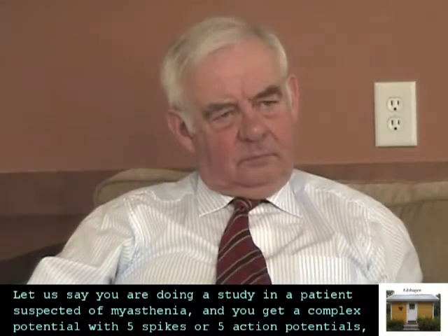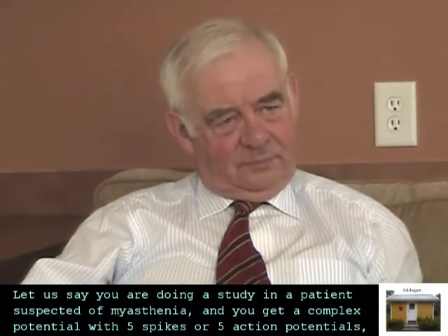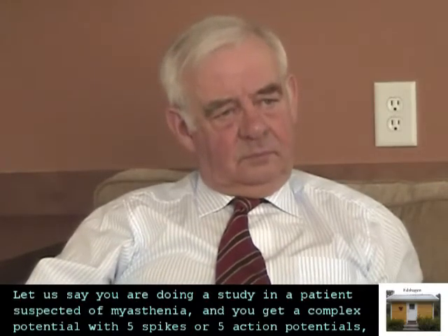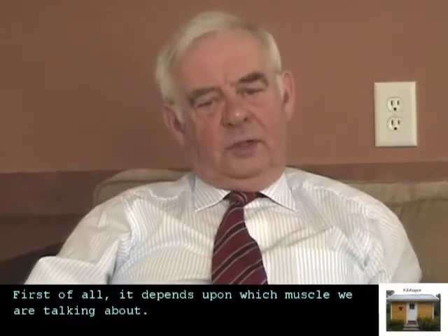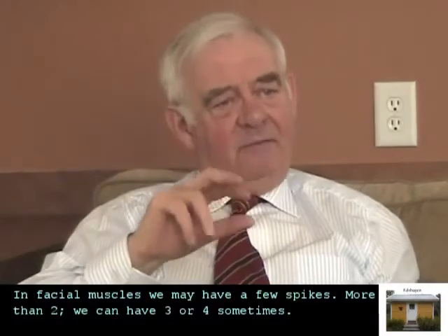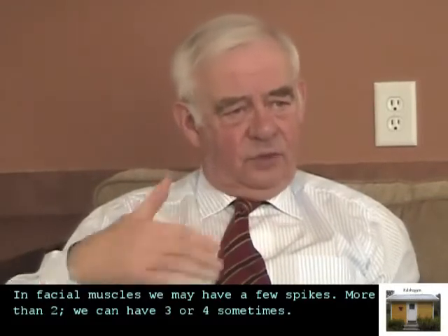Let's say you're doing a study in patients suspected of myasthenia, and you get a complex potential with 5 spikes or 5 action potentials. How many jitter analyses can you make from that recording? First of all, it depends on which muscle we are talking about. In facial muscle, we may have a few spikes, more than 2. We can have 3 or 4 sometimes.